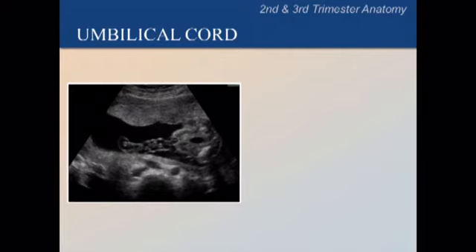Please pause the video now to allow participants to identify the umbilical cord, fetal abdomen, and the cord insertion site. Here, we point out these structures to make them more obvious.